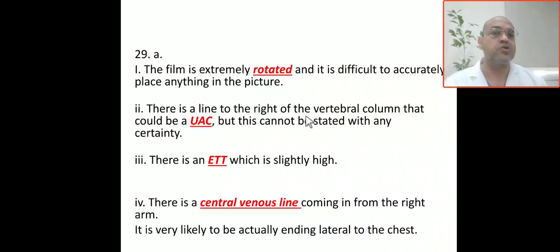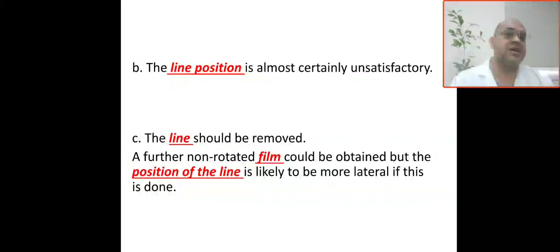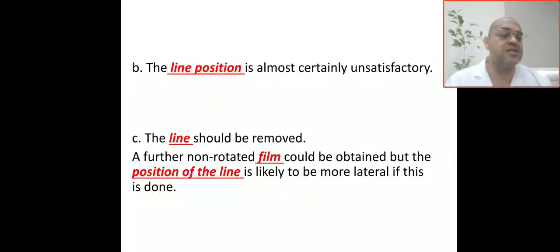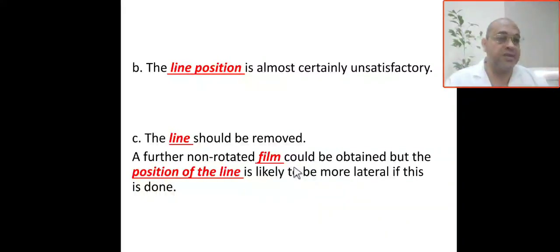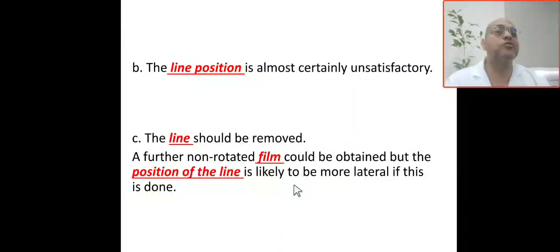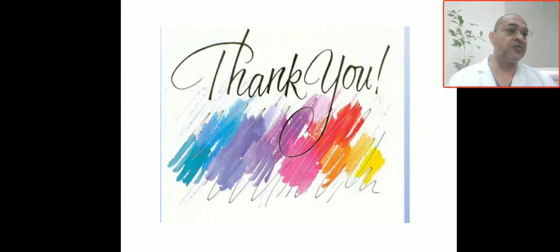The central venous line comes from the right side and is likely ending in the lateral aspect of the chest, which is unsatisfactory. What will you do? You have to remove this line, insert another one, and take another X-ray — a non-rotated film. With a proper film, the position of the line is likely to be shown as more lateral.